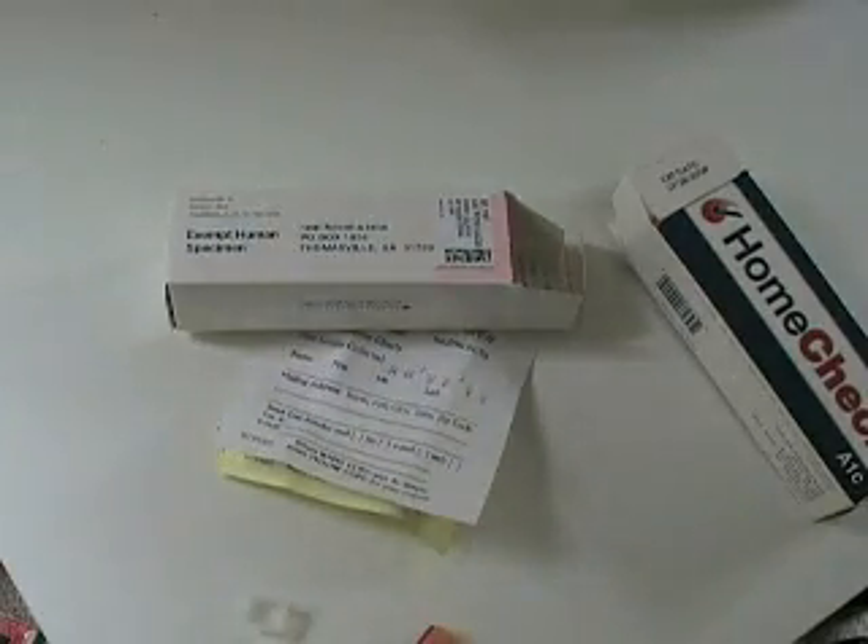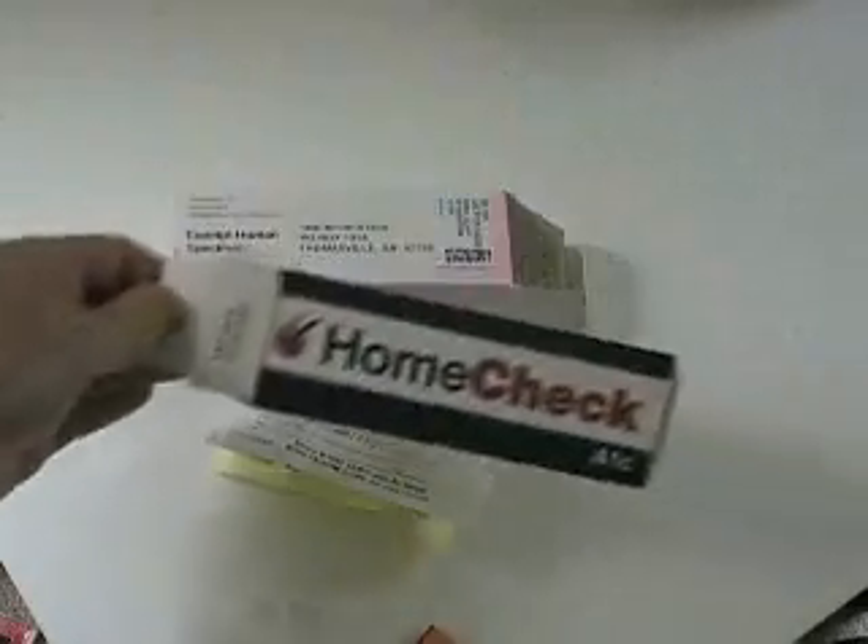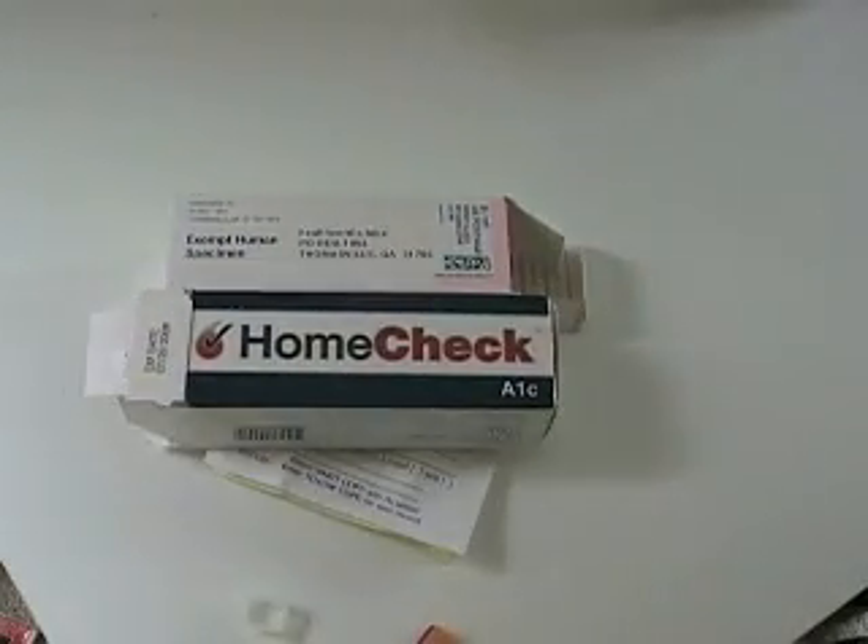The whole kit costs about $30, including postage and packing. I think that's a pretty good price, considering that some of you will probably pay a $30 copay to have an A1C test done in your doctor's office. I've used this before, and the last time it gave me a very good result compared to my doctor's office. Hopefully I'll get the same result this time too. Thank you.